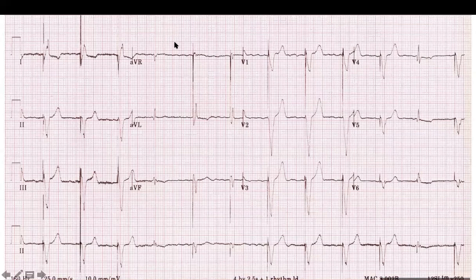I could see two different morphologies that are being paced, both of them, and the pacing is in the ventricle. One of the beats is not being paced, which is the fourth from the left. Just to be together, let's take the rhythm strip and move forward one beat at a time, instead of saying this and that two at a time, and then we'll summarize what we found. Okay, go for it.